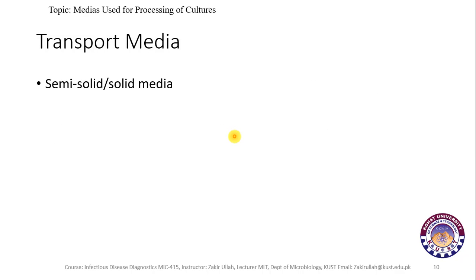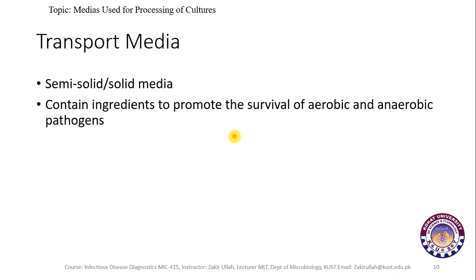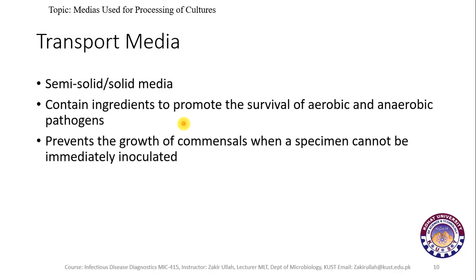Transport media can be semi-solid or solid media and, as the name indicates, are used for the transportation of different samples to the microbiology labs. They contain ingredients which promote the survival of aerobic as well as anaerobic pathogens, and they prevent the growth of commensals or normal flora.